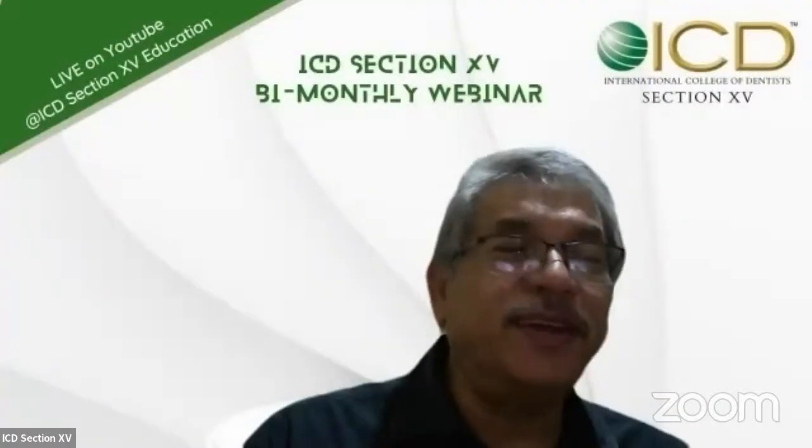But if you talk about 3D printing, you need radiological data, and you need to have a big lesion, for example. You need to construct based on accuracy, like PSI, for example. So that is the kind of lesion we look into when we do 3D printing, not a small lesion like periodontal disease.